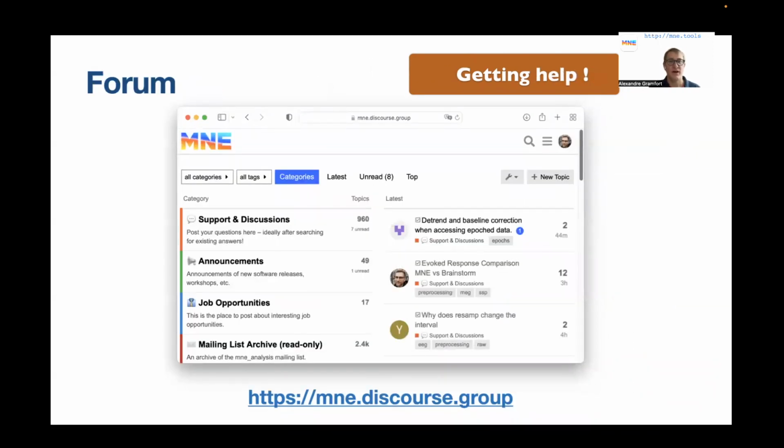If you need help, there's also a nice forum that was set up. So if you go to mne.discourse.group, this is where you should ask your questions. And the hope with this forum is that the knowledge is actually disseminated, shared, and also questions can be answered broadly by the community and not only by the historical core developers of the project.